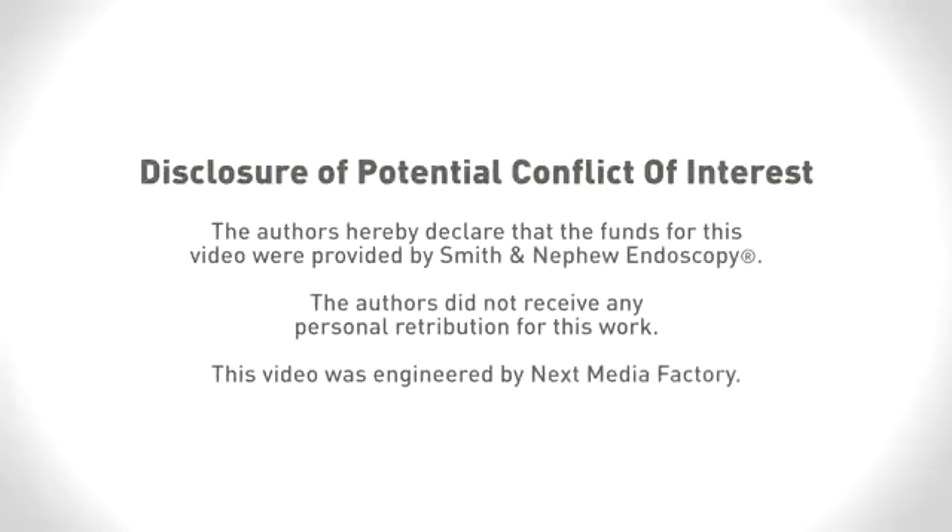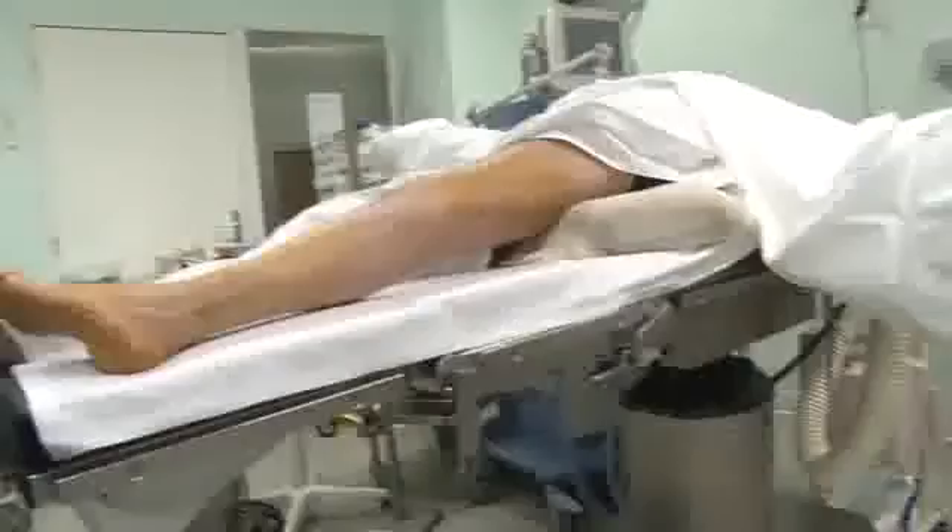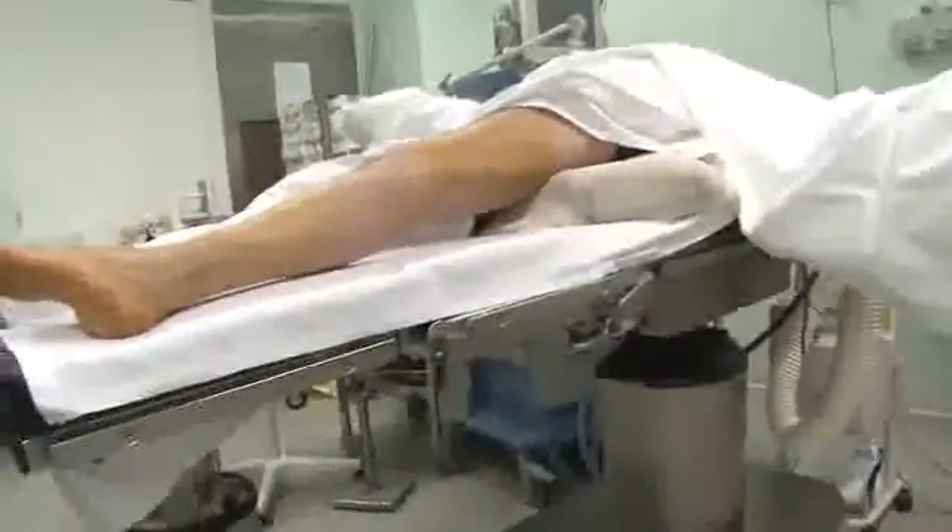This video describes the lateral approach to the sinus tarsi for arthrodesis of the posterior subtalar joint. The patient is positioned supine with a support underneath the buttock and opposite on the pelvis.